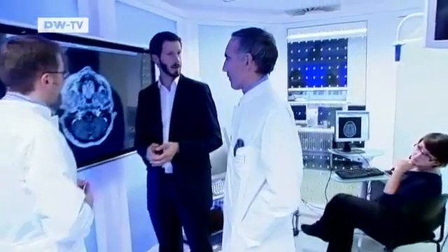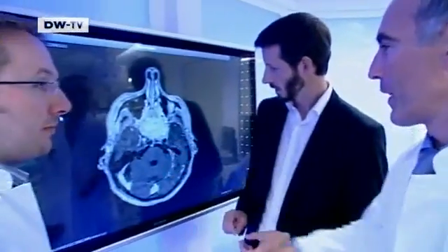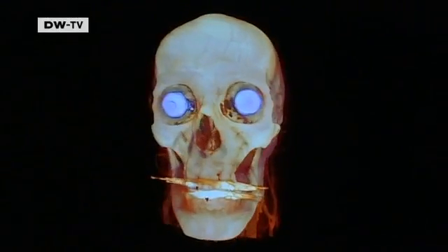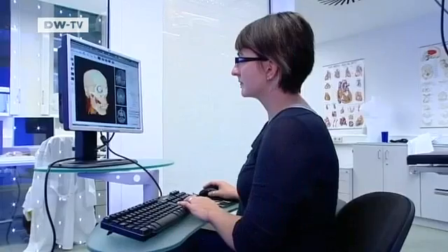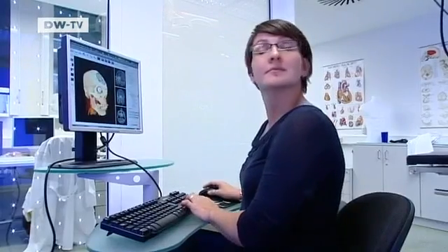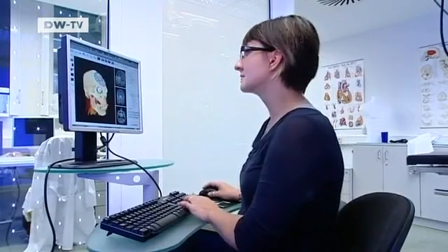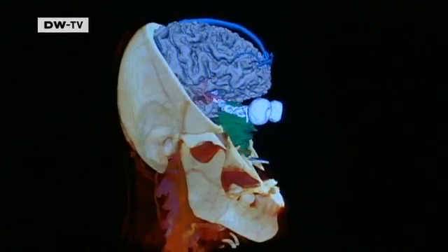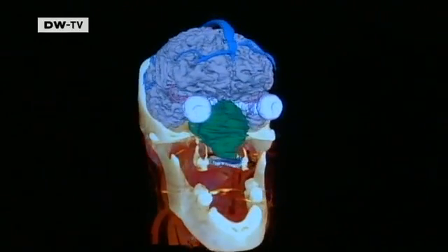A computer program transforms the images into a three-dimensional model. It gives the doctors a good look at everything. With the click of a mouse, bones, blood vessels and even the brain can be removed from the virtual patient's head until the tumour, shown here in green, is visible from all sides.